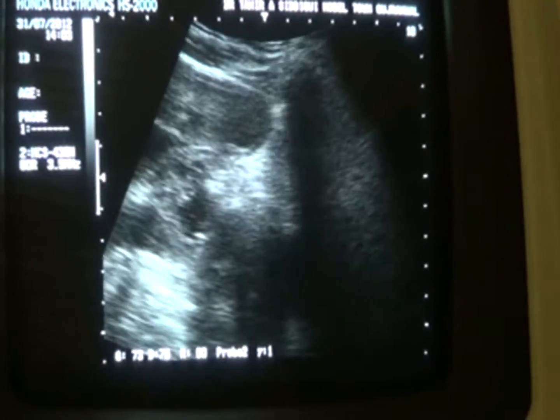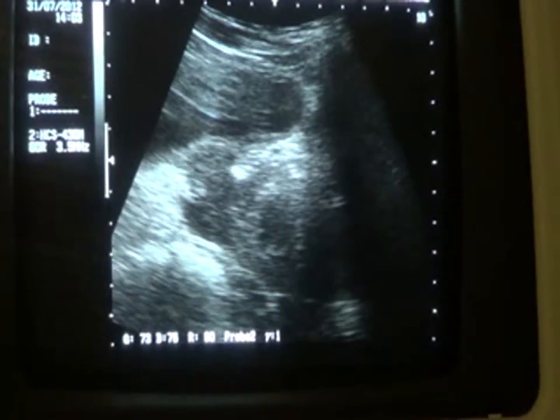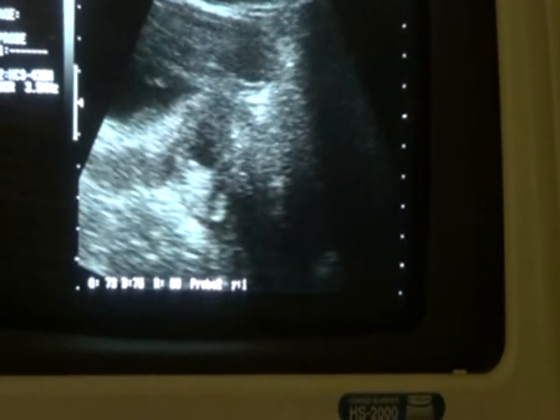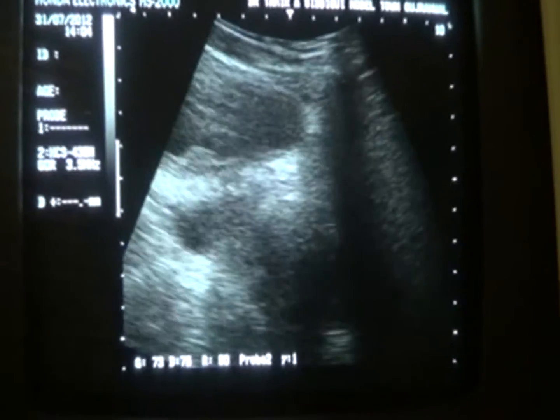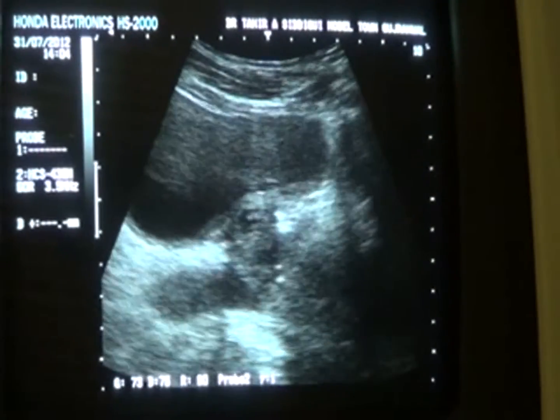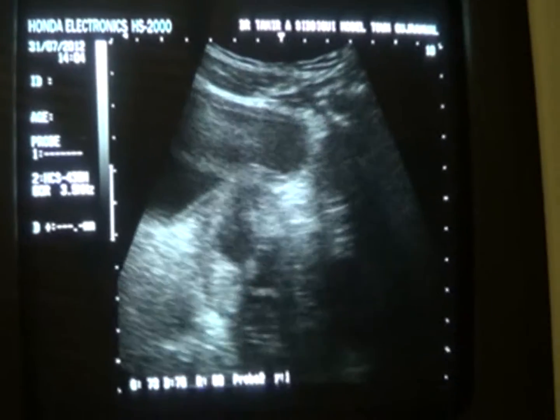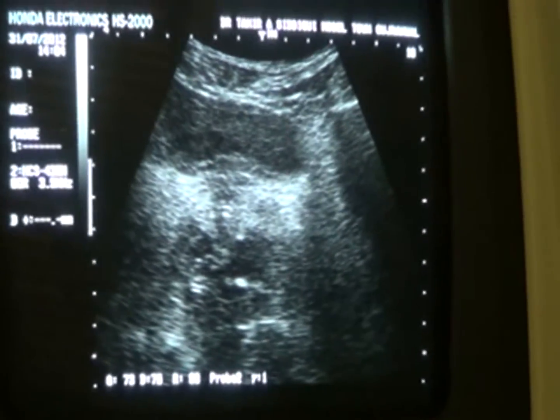Now the other one that is seen in the left posterior lobe of the prostate in longitudinal. This is the initial one. Now this is the seminal vesicle in longitudinal section. Now let's get the other one in longitudinal section. Here we are with both of them being seen. However, the larger one is more clearly seen in transverse section. This is where it is.